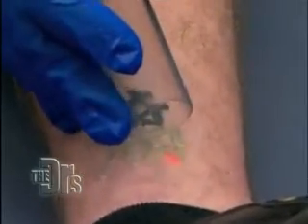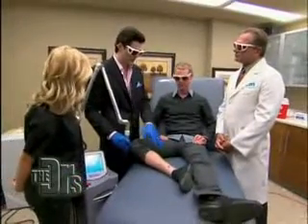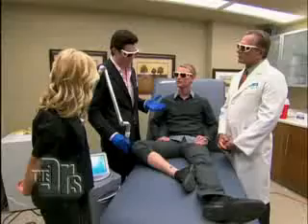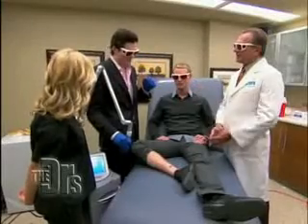It's disappearing. And there's certain color lasers that respond better, correct? Absolutely. Black is the ideal color to treat, and Josh is really pale, so he's a great candidate. You can clearly see the great result he's getting here. Earlier in the show, you showed some before and afters, and they're sometimes a little bit difficult to discern. Right here, you can't deny it. And that's how the laser works. It targets the color, the pigment, in the skin itself.